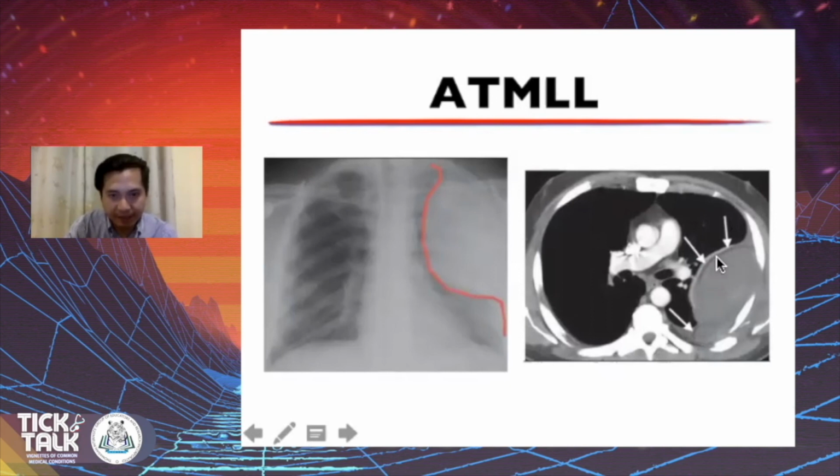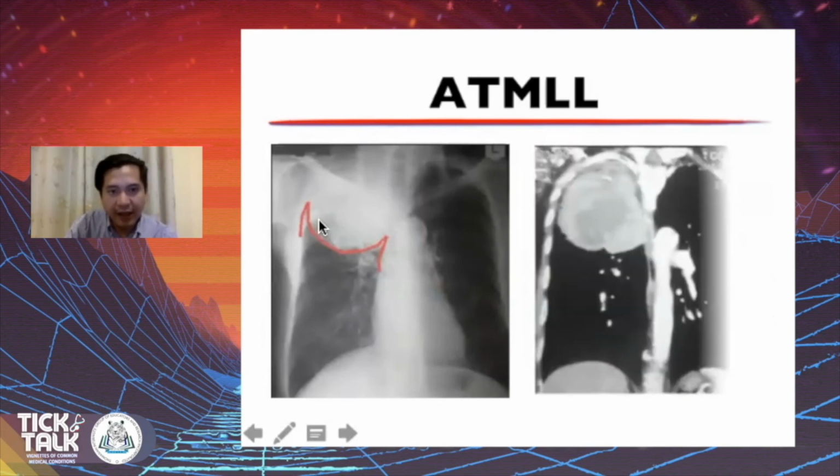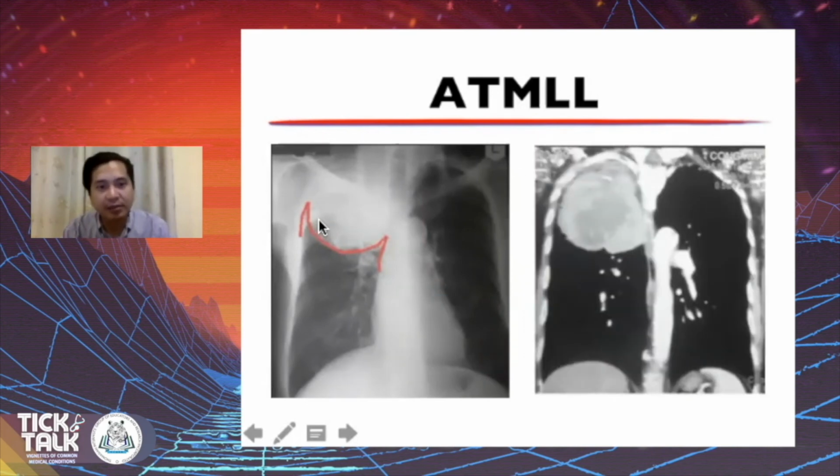See the visceral pleura. This is pleural based. The mass or the problem is inside the pleura. While in this X-ray, when you draw an outline, the angles are acute, signifying a parenchymal lesion.